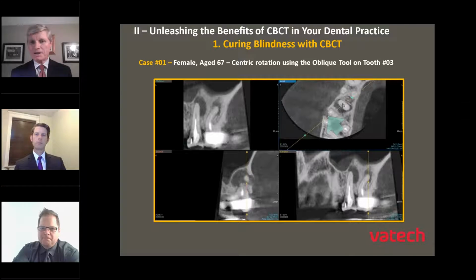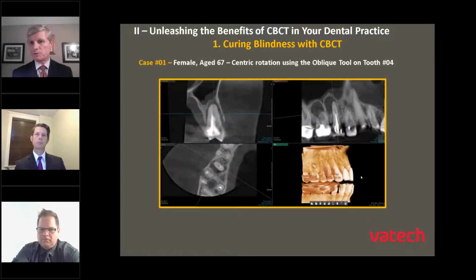Absolutely. And you may not even notice it necessarily, but if I bring my mouse, I don't know if you can see my mouse on here, but you can see there's communication now going on between the buccal cortical plate and the cheek. That certainly is not evident when looking at the PA itself, and then you can see a better extent as far as how it's communicating perhaps either with tooth number 3 or even going into the sinus cavity here as well.